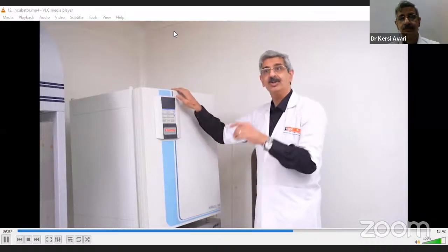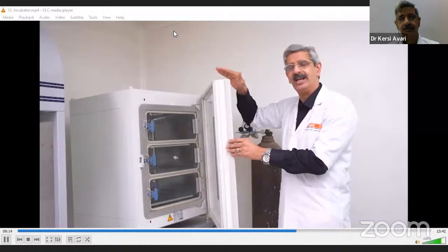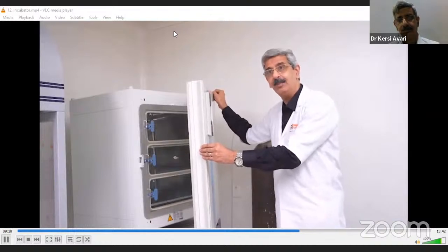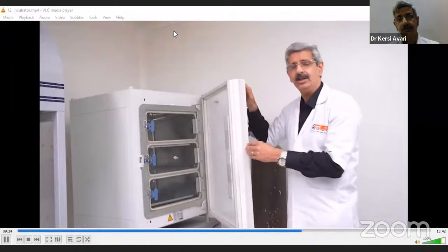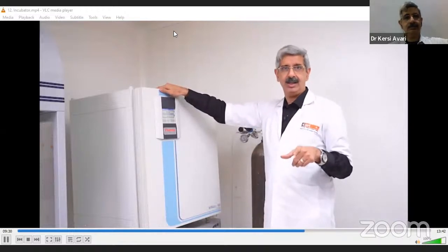That's very important. So when you open the door, many have a nasty habit of hanging on the door and looking in. So please don't put inadvertent pressure on the door. All the circuitries are maintained through it. This is the important part as far as QA/QC is concerned. Cleanliness: well, you have your auto sterilization, but still a little bit of manual cleaning is essential.